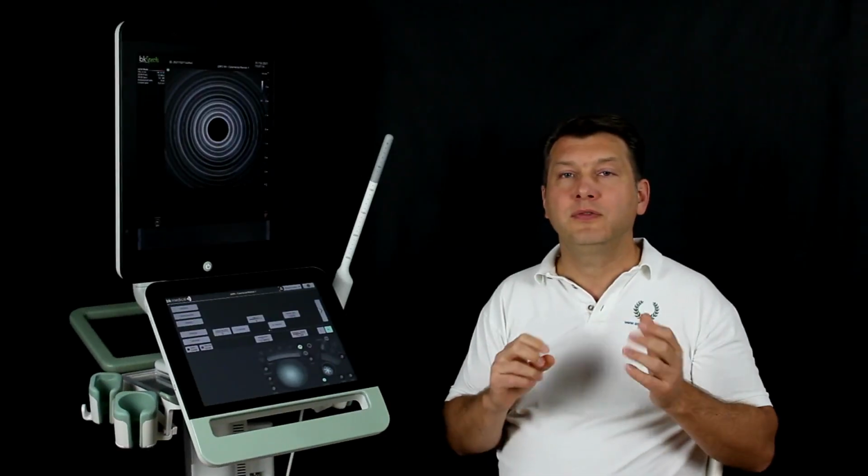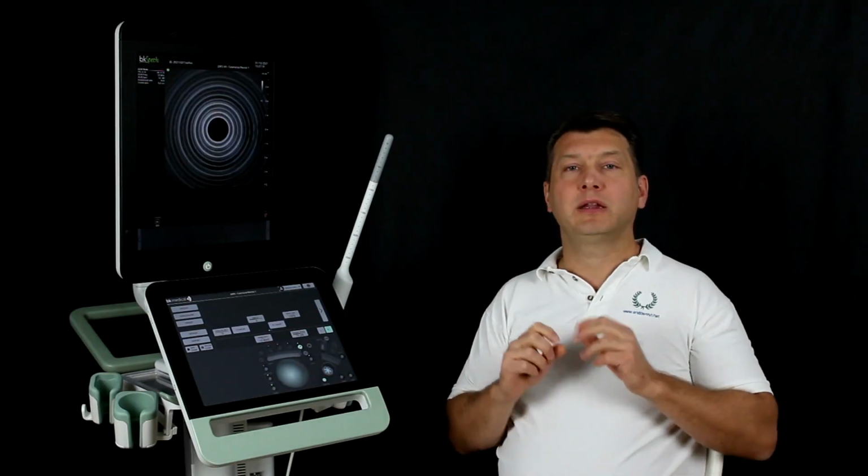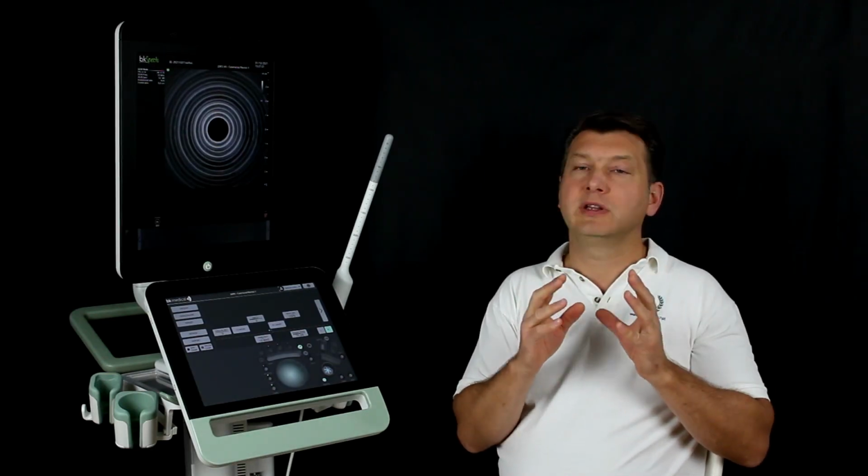As you see, a few rules must be obeyed. If you pay attention to these, the diagnostic will definitely succeed.